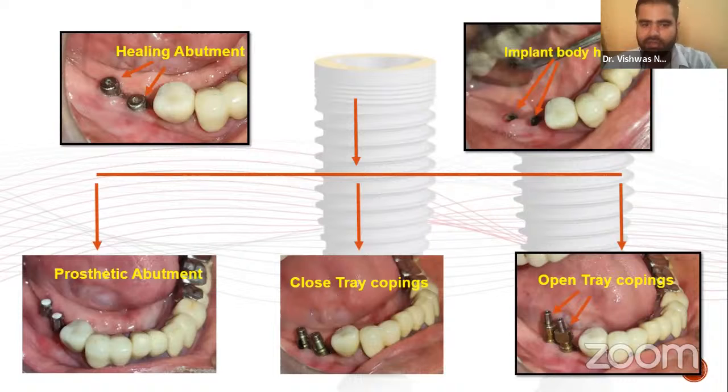After that, we can use any of these three pathways. The first would be directly seating a prosthetic abutment and taking an abutment level impression. This is the most preferred method by clinicians who are, you can say, non-prosthodontists, because this is the easiest to apply. It basically works in the conventional FPD manner. Or we can simply apply a closed tray or an open tray and take the following impression.